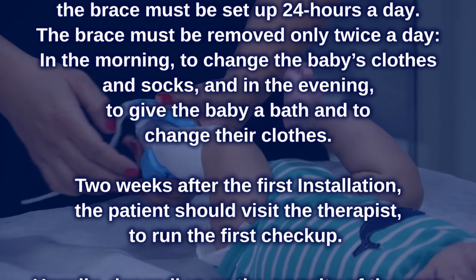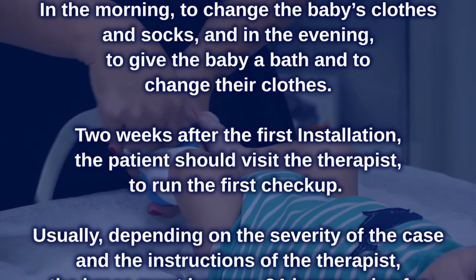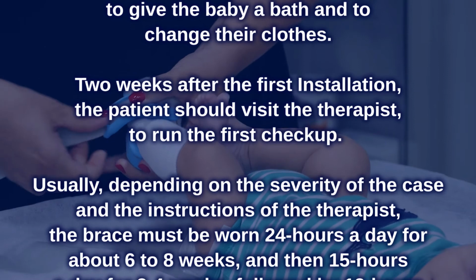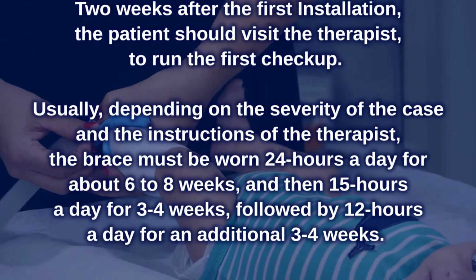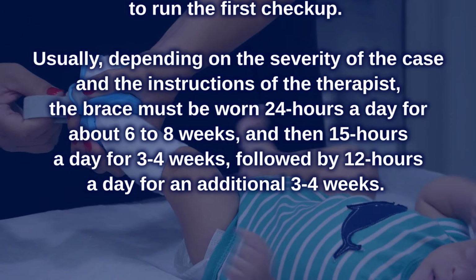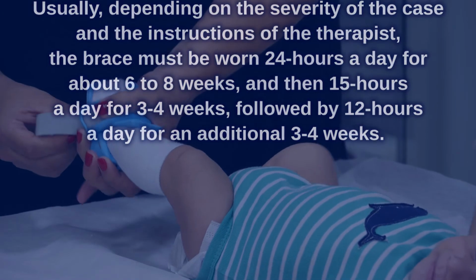2 weeks after the first installation, the patient should visit the therapist to run the first checkup. Usually, depending on the severity of the case and the instructions of the therapist, the brace must be worn 24 hours a day for about 6 to 8 weeks, and then 15 hours a day for 3 to 4 weeks, followed by 12 hours a day for an additional 3 to 4 weeks.